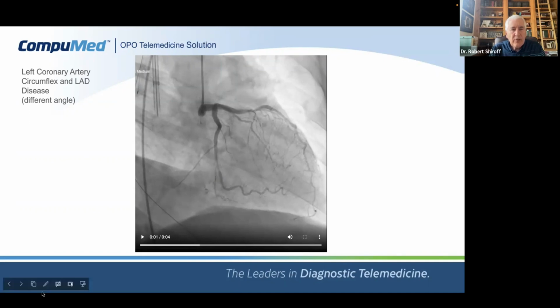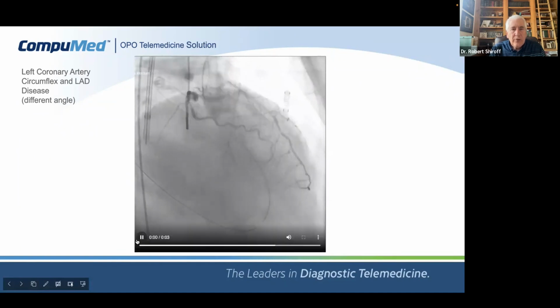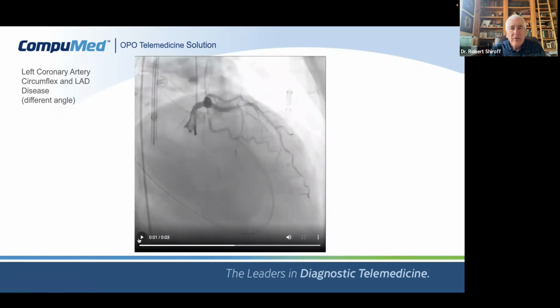And to show you how different things are, a third view, which is called an axial view, where you shoot the picture from the feet toward the head. You angle the camera as well as a rotational. It moves anterior posteriorly from the feet toward the head.